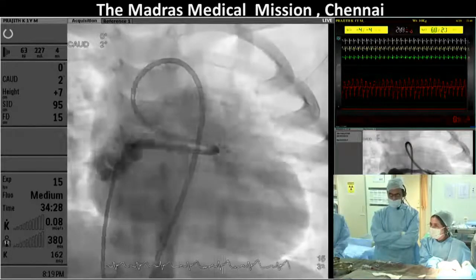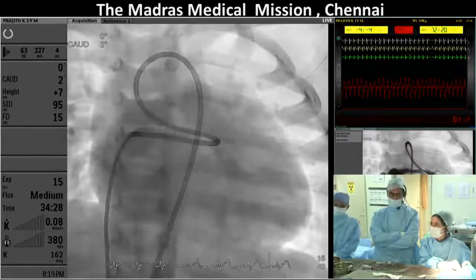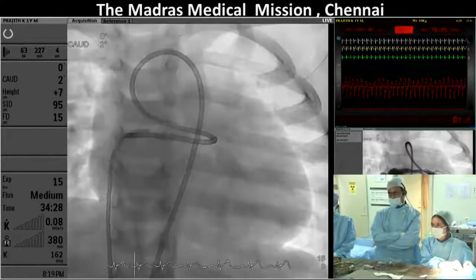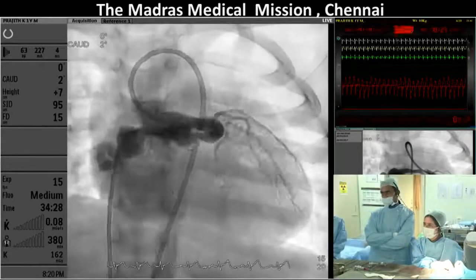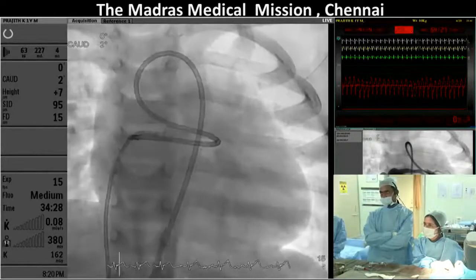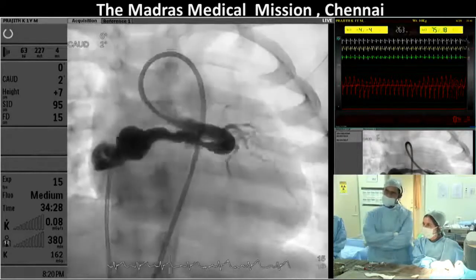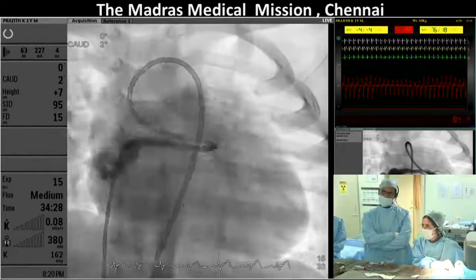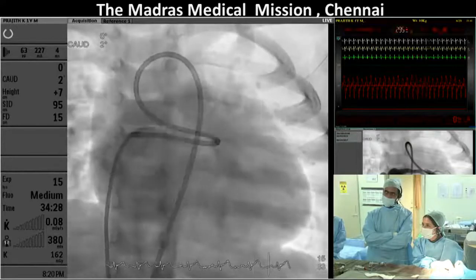Now, dynamics of this sac, pressure-wise, what is it now, and what do you expect it to be after you obliterate the exits? And will that affect the flow to that artery? I think you're making a very good point. Me personally, after the holes got closed, or even before, I would fill that sac with metal, and it would be coils.